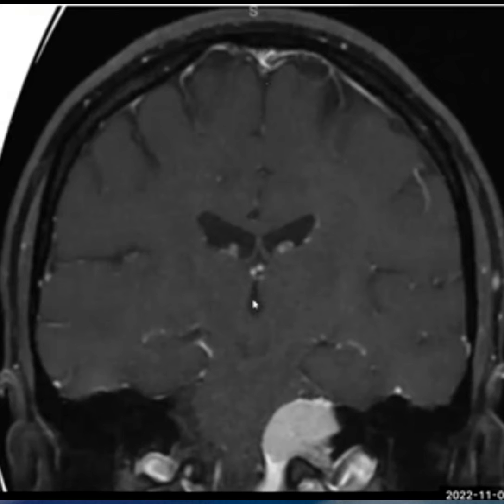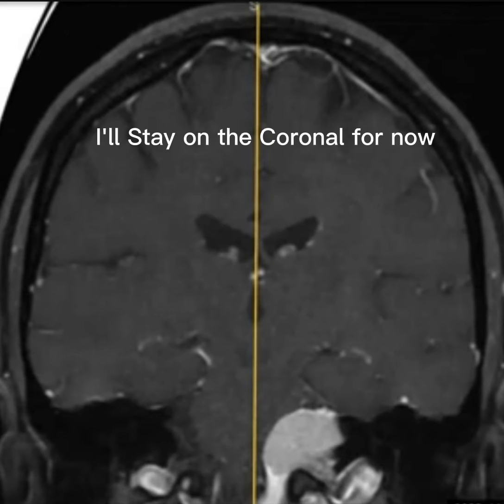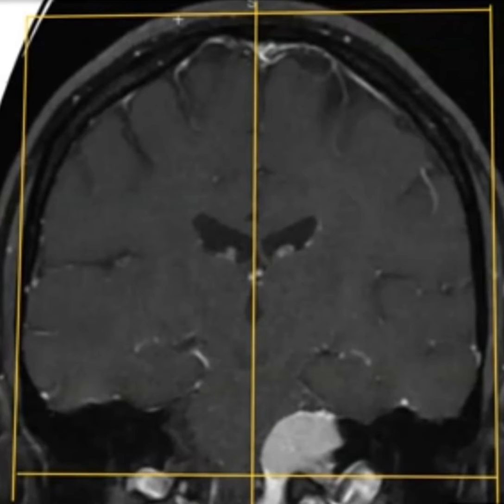For example, we have the third ventricle on the coronal, which we can see really clearly, and the midline on the axial plane, also very perfect anatomy for cutting like that. Slice coverage will be from temporal lobe to temporal lobe, or from ear to ear, from pinna to pinna. So we also make sure that the ears are included.